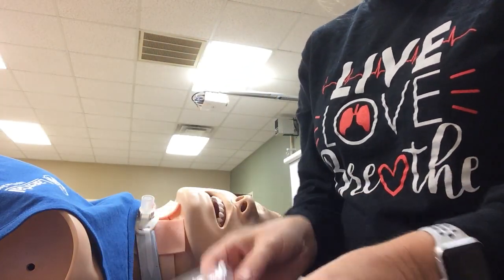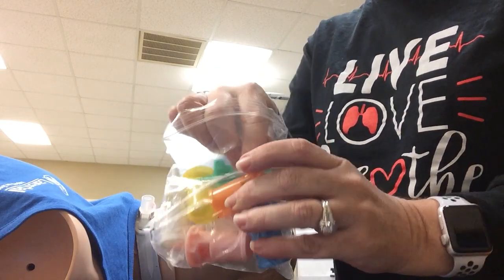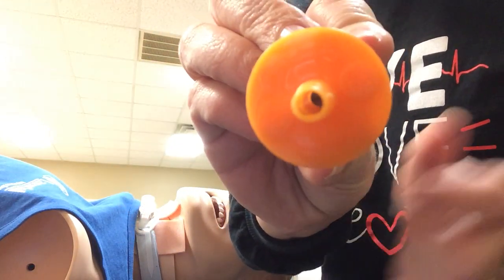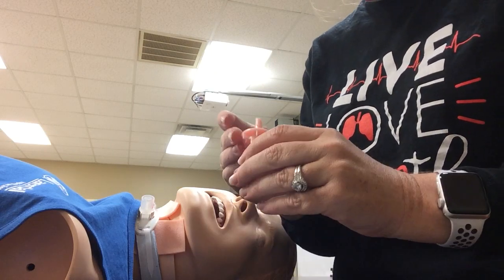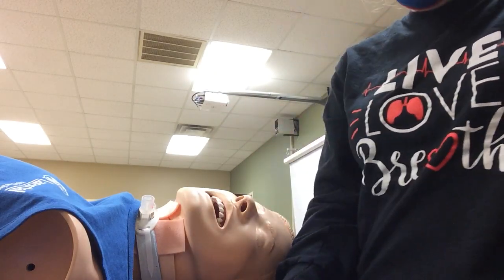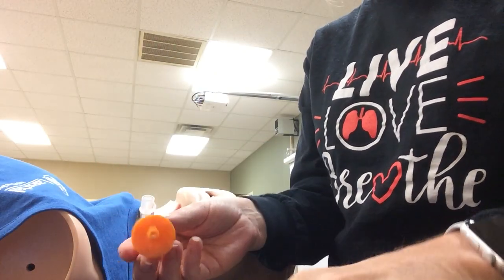The first thing you want to do is decide what FiO2 you need. If you need 50%, you would find the orange one — it has 50% on it right there. It's easier to see when you're looking at it. This one is 40%. So determine your FiO2 and we'll just do the 50% one.